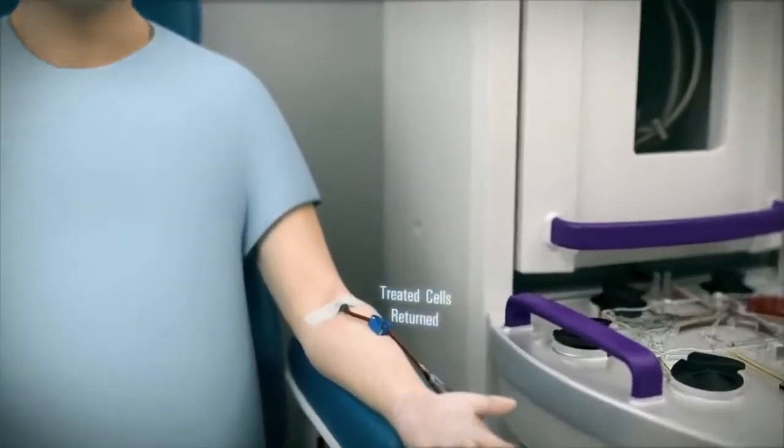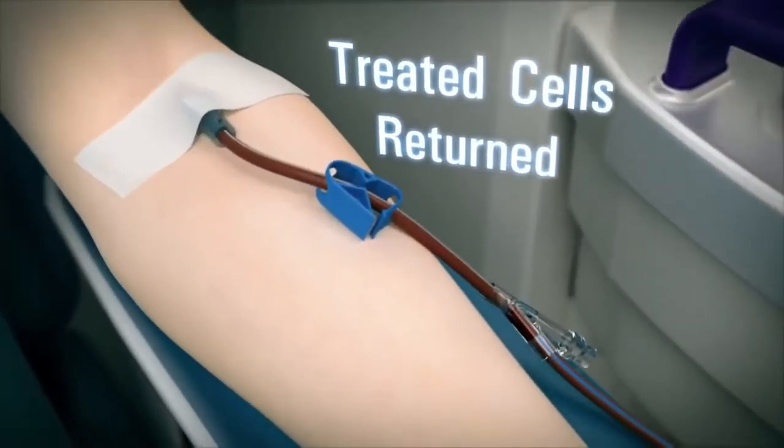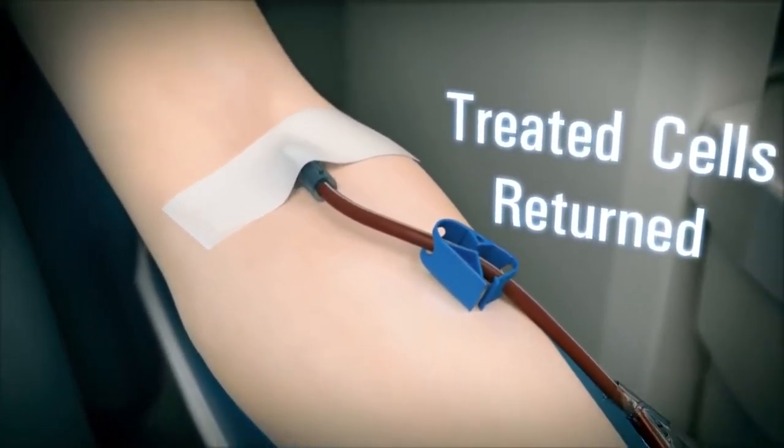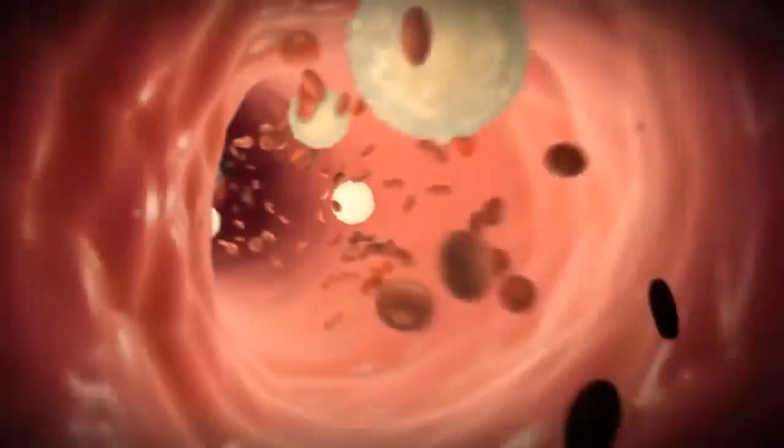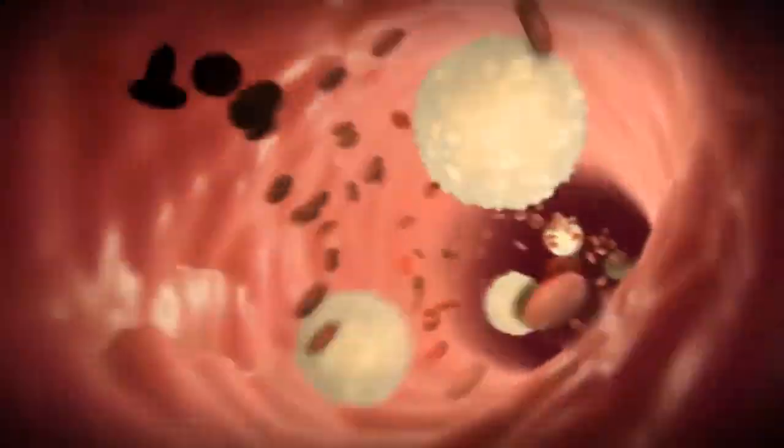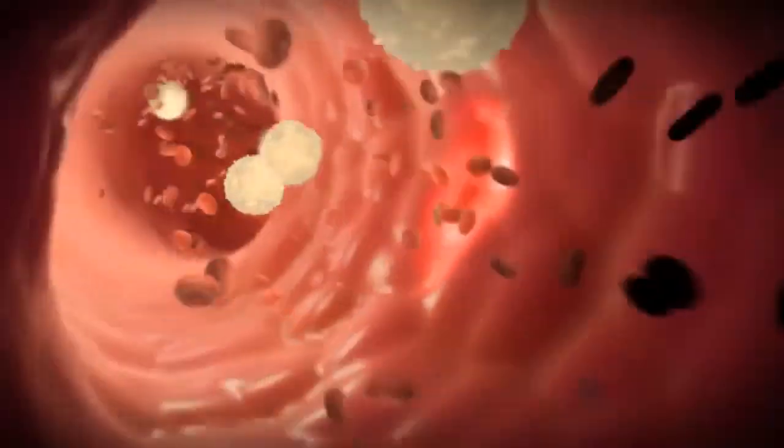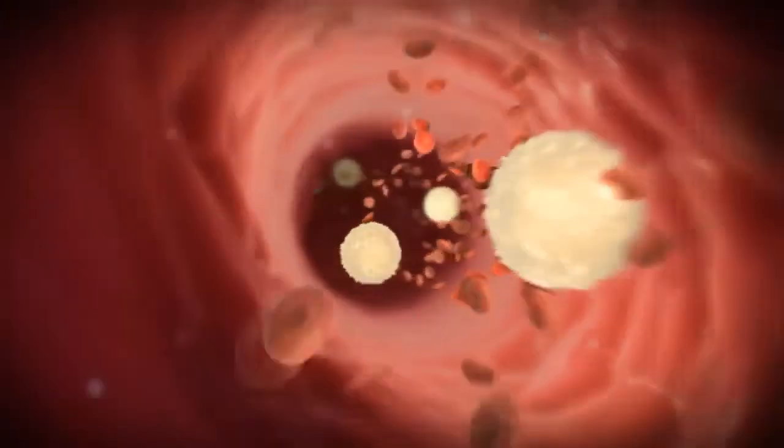The methoxalin treated buffy coat cells, now programmed for cell death, are then re-infused into the patient via the return line. Upon re-entry to the body, they begin accumulating in the liver, spleen, and the lymph nodes where they will be eliminated by resident antigen presenting cells.